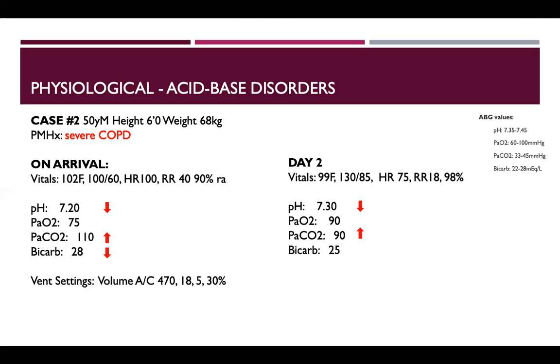Should we tweak the settings a little bit based on this ABG? Is he fine? Do we know what his baseline sat is? No, I don't have that, but let's say it's 90. Victoria, why are you interested in this saturation? Since Nancy gave him severe COPD, if he normally is at 90, 92, then being at 98 might be depressing his natural respiratory drive as well.